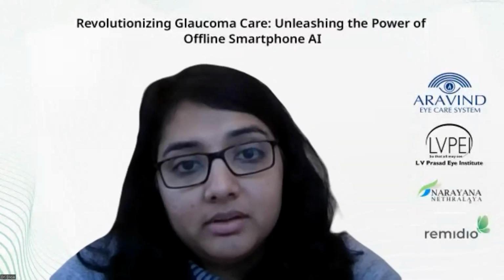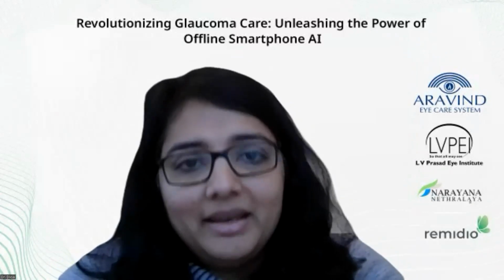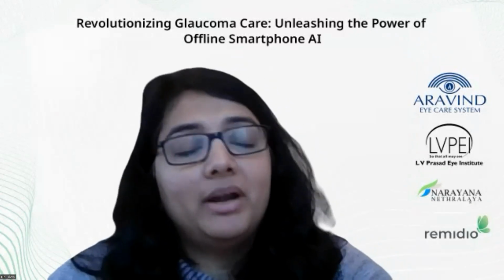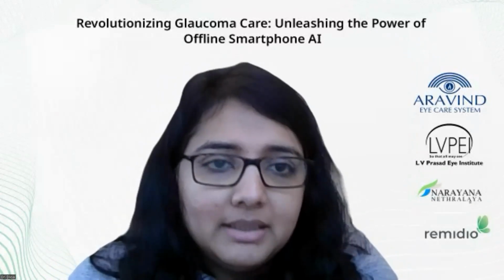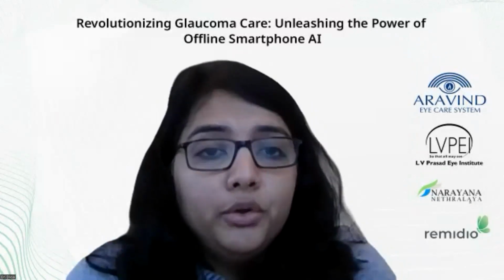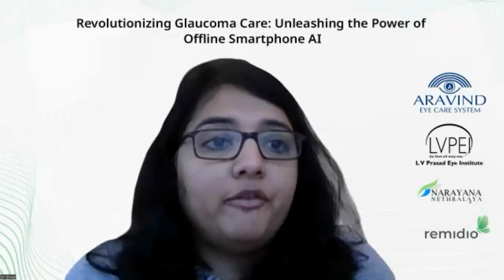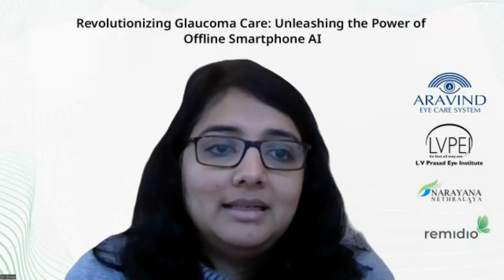So I think one thing we really need to emphasize, which I also mentioned during my talk, is that there's a disclaimer in the report that this is a screening report. The AI is only analyzing and providing a screening report, and this does not eliminate the need to visit an ophthalmologist. That's one. And when you're using it as a clinical assist tool, like with any other investigations like HVF or OCT, for example, OCT has segmentation errors in small and large discs. You know that it's not very reliable. And HVF can have false positives and false negatives.